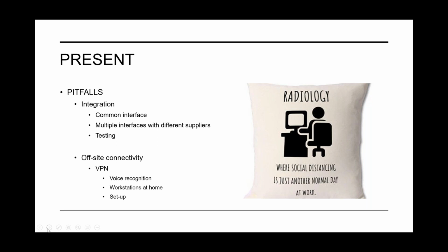I mentioned integration, and essentially that stemmed from standards, HL7. Some systems we didn't have specific HL7 interfaces, so we had to get them created. And certainly in our own experience, we had to move from a different type of interface, which was very useful for the way we worked, to HL7. What we learned was there's not a like for like mapping. When you move from something like Oracle Views to HL7, there's not a specific like for like.